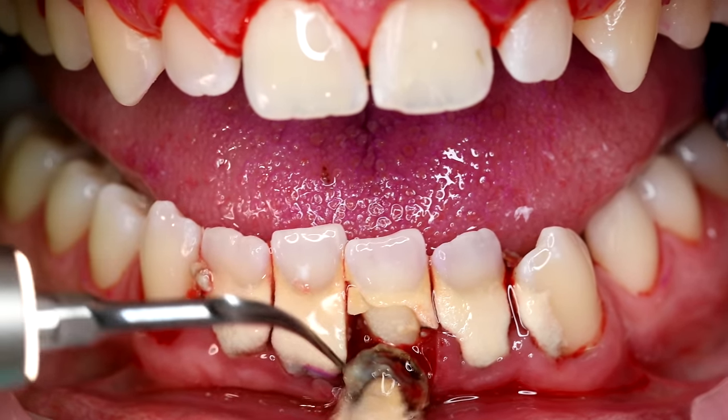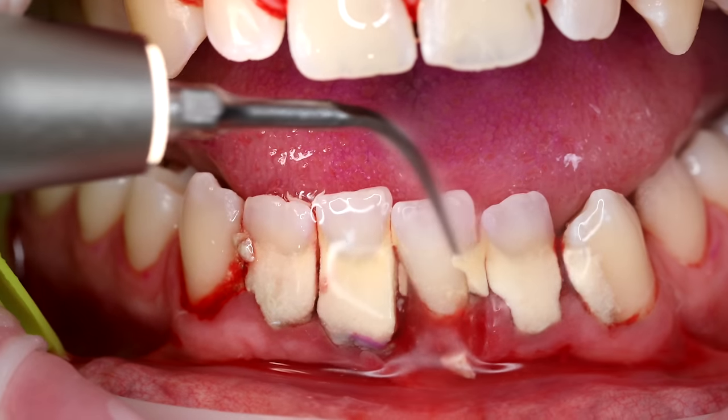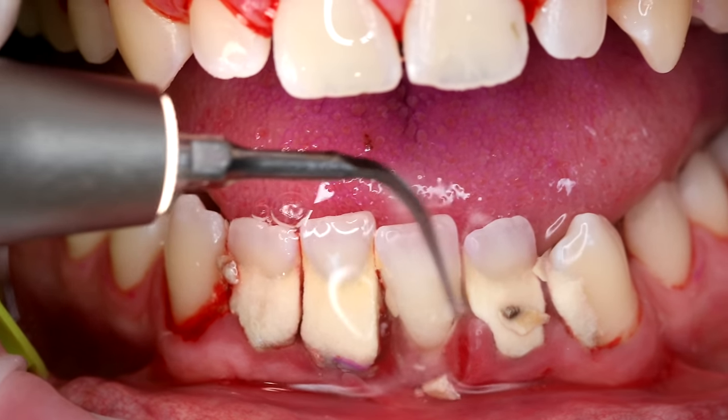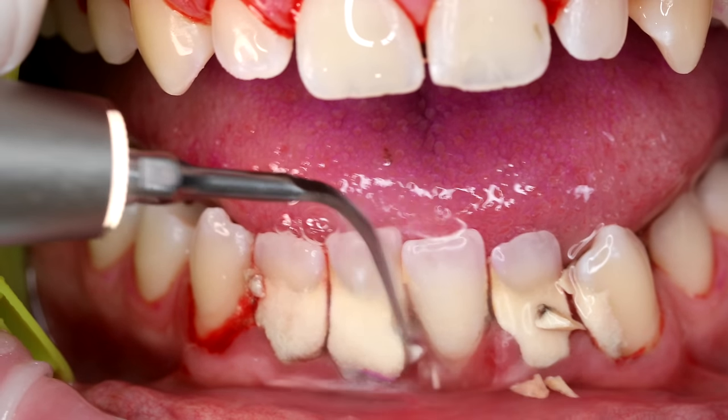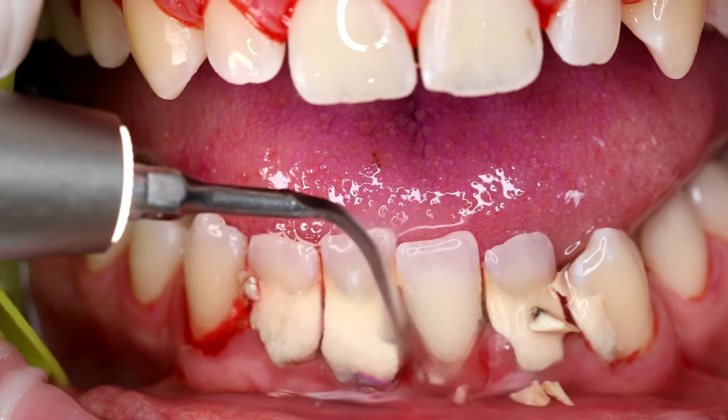This has to be one of my favorite clips I've ever recorded. I mean, how satisfying is it to watch an ultrasonic remove calculus off of teeth, especially when there's this amount? These ultrasonics are super cool.